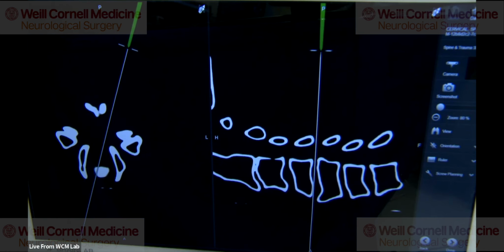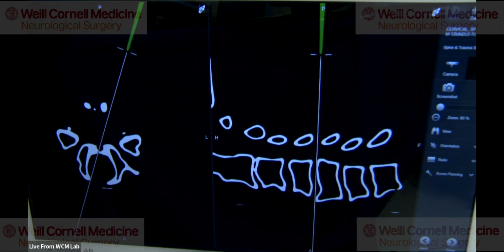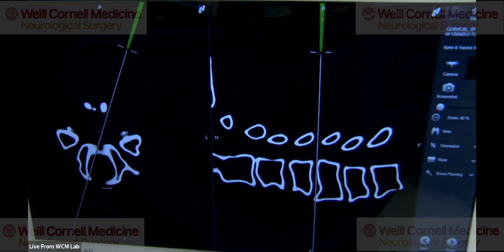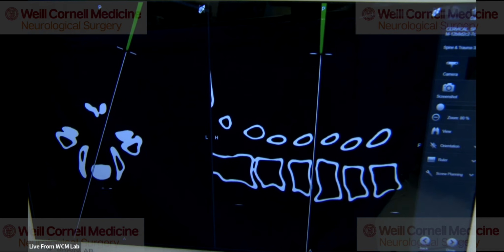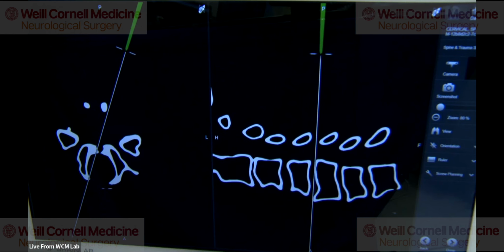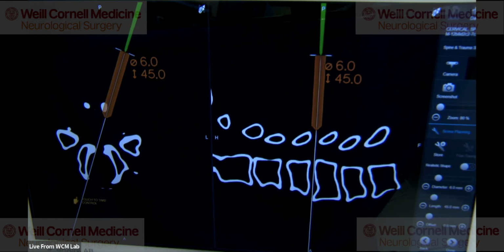In this particular case now, I'm pointing at the C4, C5 disc space. Now, what I like to do, and Evita, maybe you can help with that, because I don't want to have to go always back and count from the skull base. So what I actually do, I drop a marker into the C4-5 disc space.